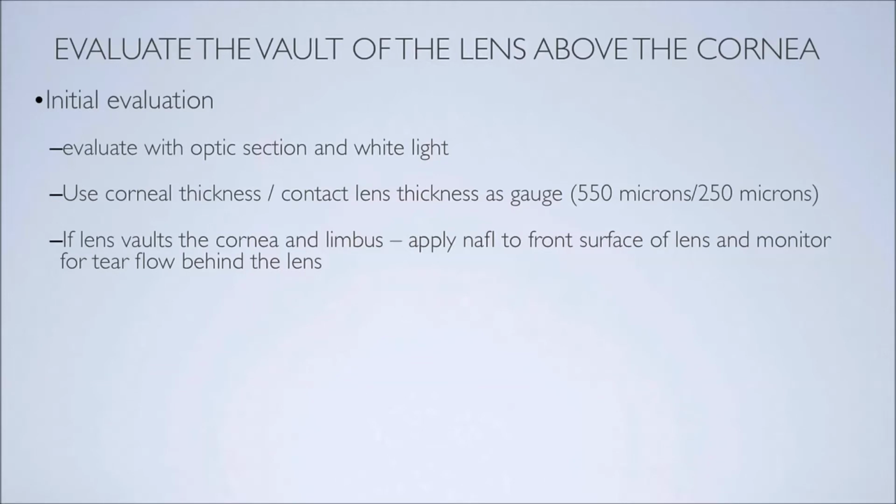If I apply fluorescein to the front surface of the lens, it's a little easier to see the lens profile.